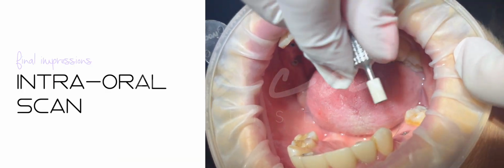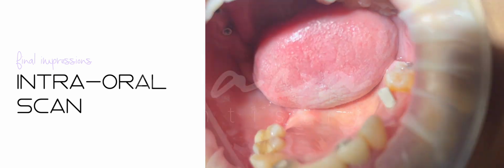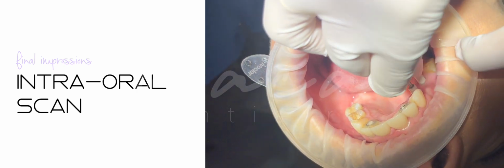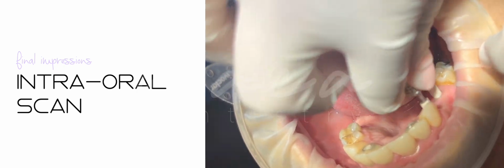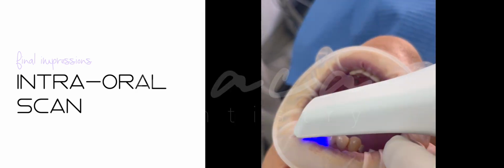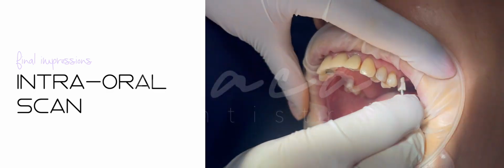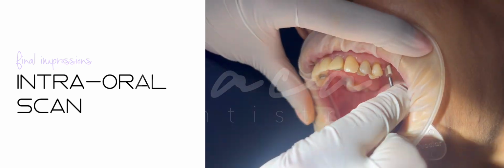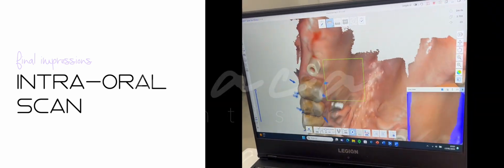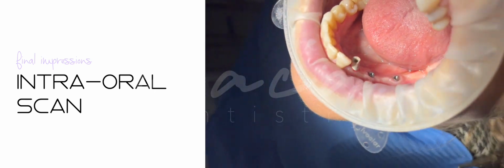In this case, we opted to follow a complete digital workflow, and here you can appreciate a video of the final impressions. You can see scanning the upper arch, teeth and the scan markers. Then here on the single implant of the 26, and finally the implants on the third quadrant.